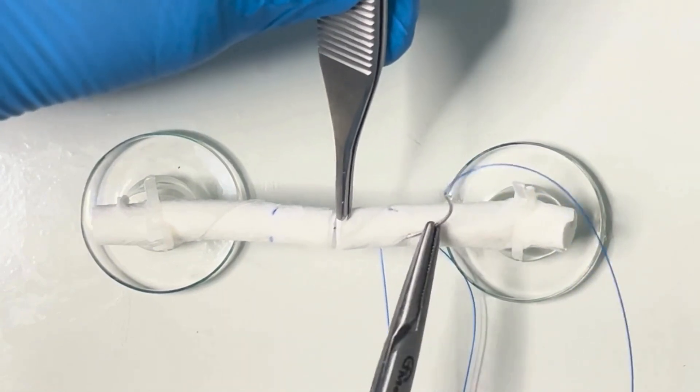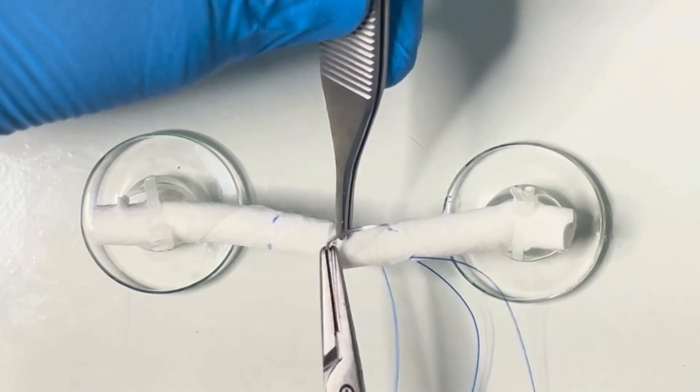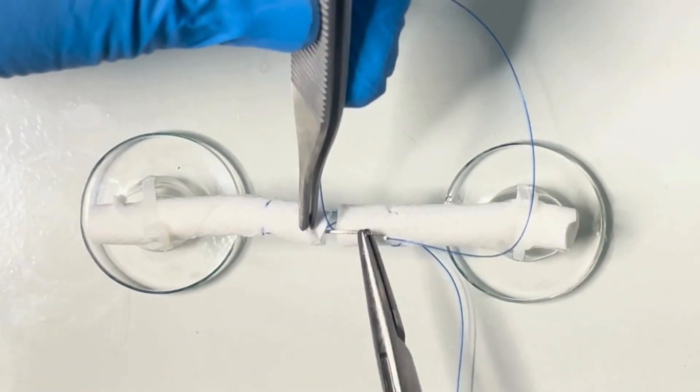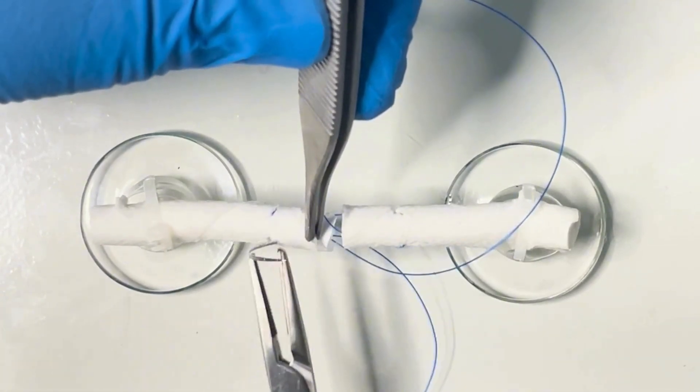Tying at this point would make this a two-stranded repair. I want a four-stranded repair, so I will repeat the process, placing the stitches before my previous ones.